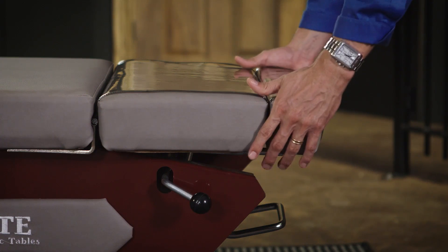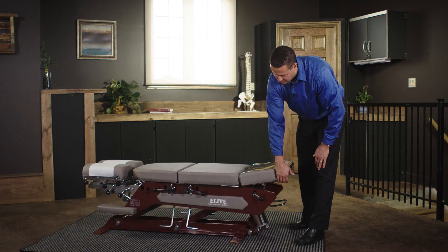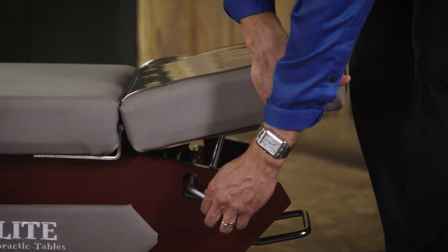The table starts at 18 inches and has a 6-inch elevation range. We have the extension for the table to accommodate different heights of patients. We also have the ability to raise the knee break — simply lift on the cushion and lift the lever to bring it down.